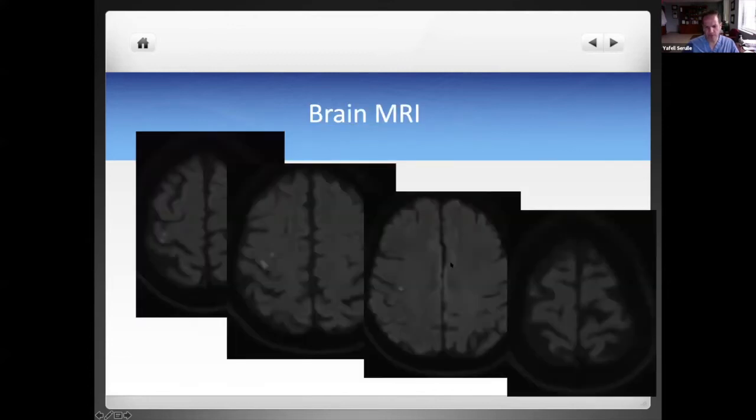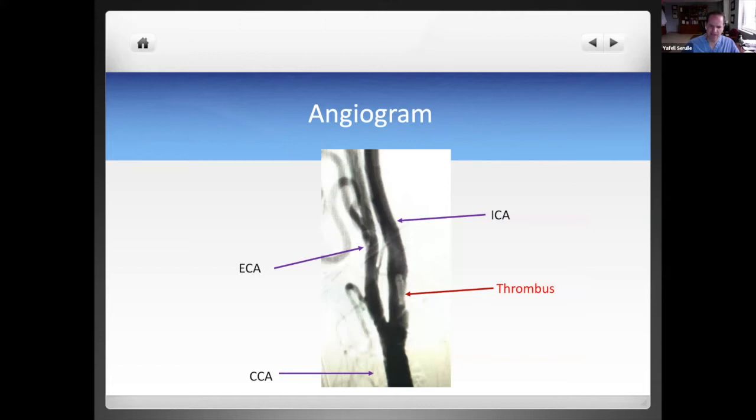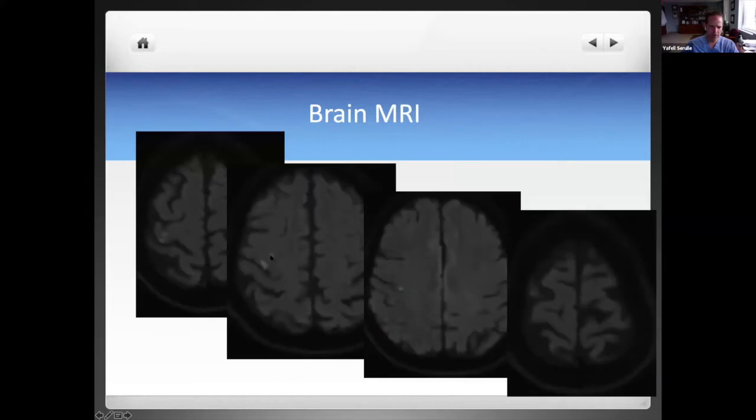So, so far, the last piece of evidence that we need is to look directly at that blood vessel. So we brought the patient to the interventional suite, and again, we put a catheter in the right common carotid artery right here. We injected contrast, and we saw this thrombus in the internal carotid artery. If you remember the anatomy from the prior case, you have the external carotid artery, and then you have the internal carotid artery. And then you have this filling defect with the thrombus. And we know already because of the MRI that this thrombus is not very stable. In fact, from this thrombus, it threw a few tiny pieces and caused a stroke.